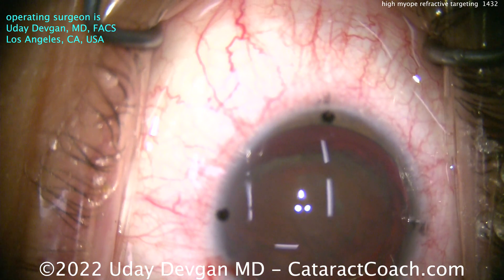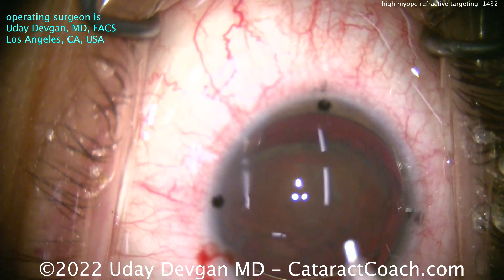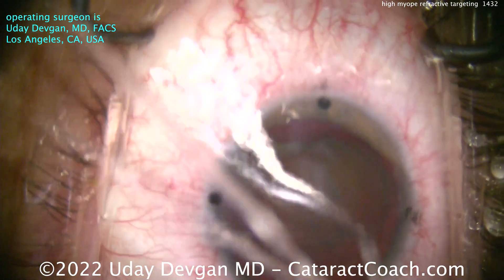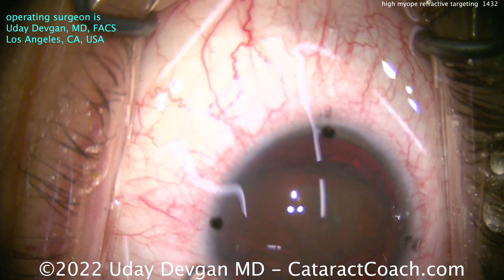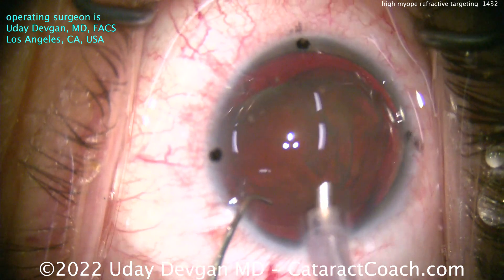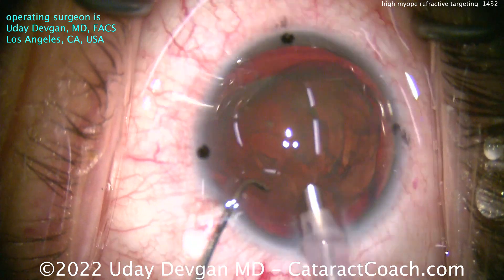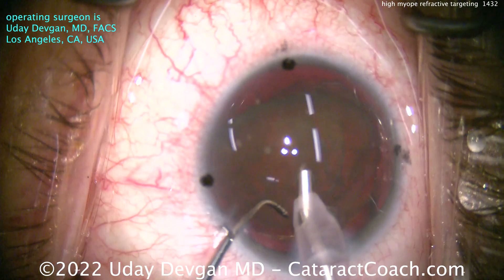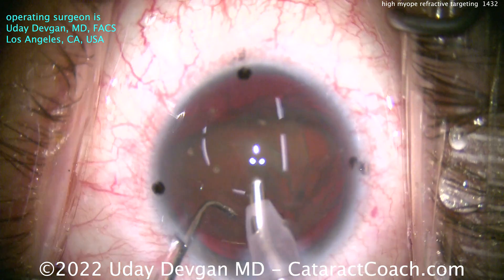In this case, we're going to take this patient from a pre-op refractive error of somewhere around minus 15 and give the patient a post-op refractive error of about minus 1.5. So that means we're correcting 90% of the myopia. The toric lens is going to correct 100% of the astigmatism, and this patient is going to be absolutely thrilled.